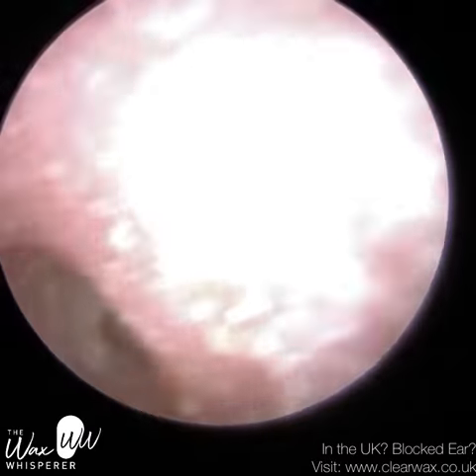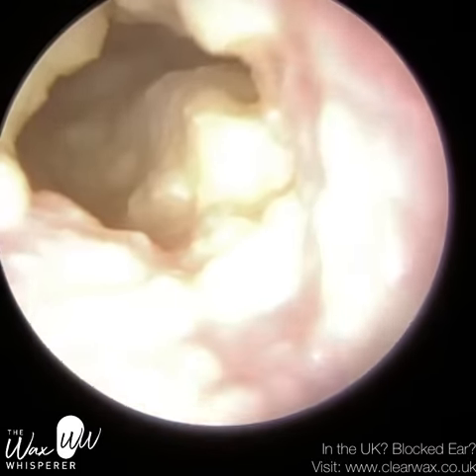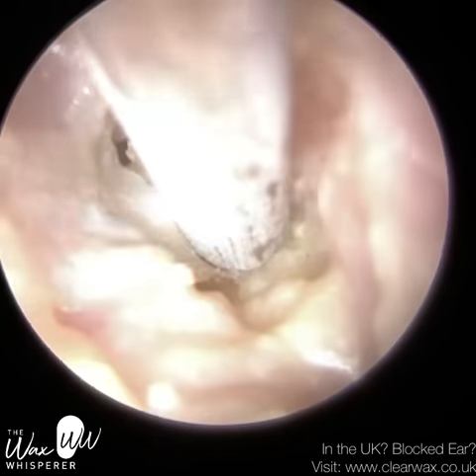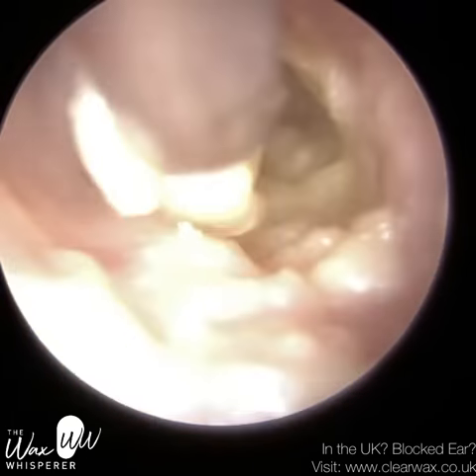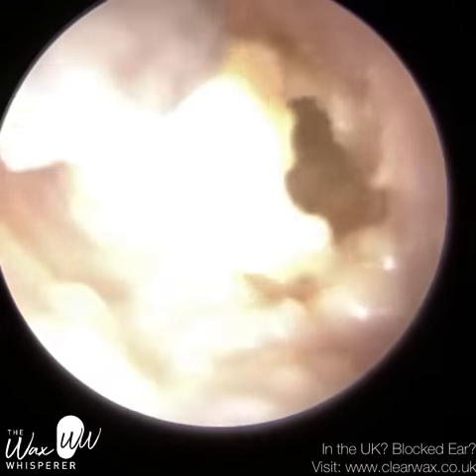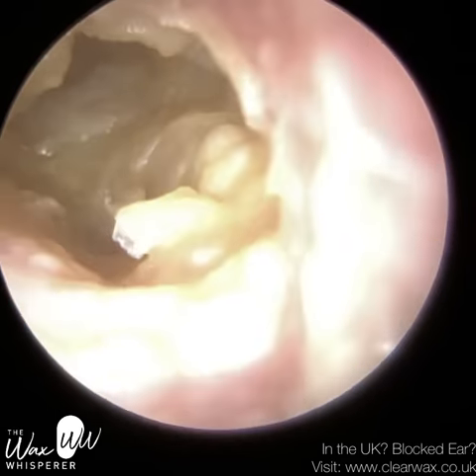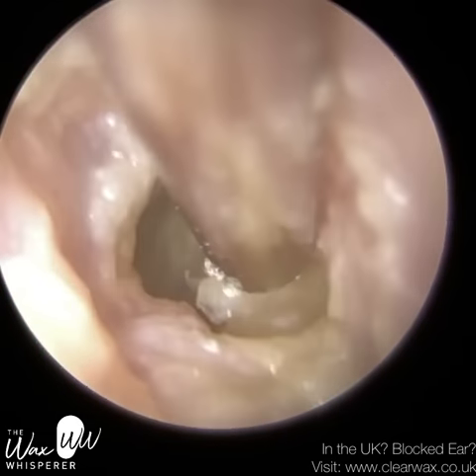This is a patient who needs to attend twice a year, and they suffer from chronic otitis externa. Otitis externa is an infection of the ear canal, and they experience inflammation — edema of the ear canal. You can see it's really swollen here. Loads of otorrhea, which is ear pus, and a buildup of dead skin keratin. This is the patient's left ear. The right ear was actually the more complex one, so do stay tuned — you will see the procedure for the right ear.